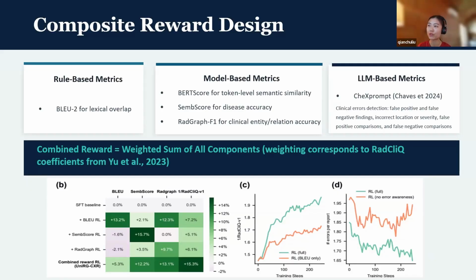So we think it's still very useful to have these model-based metrics, such as BERTScore, for example. It will at least steer the model toward writing radiologist-report-like output. So we believe that this would be more useful in terms of training the model output to be both error-free and also to be at least like a radiology report, if that makes sense. Yeah, that makes perfect sense. Thank you. Yeah, thanks for the questions.